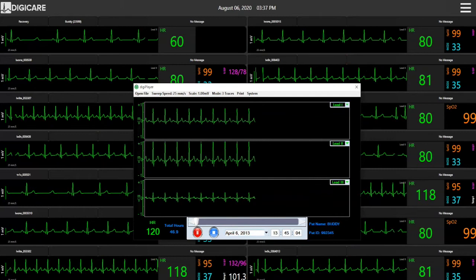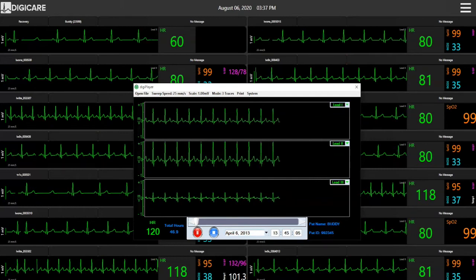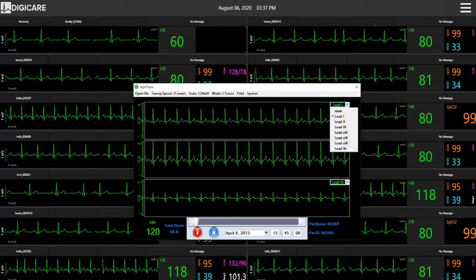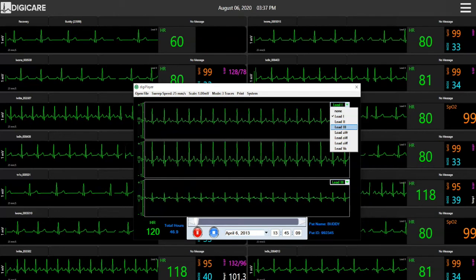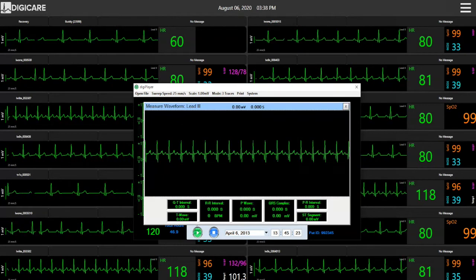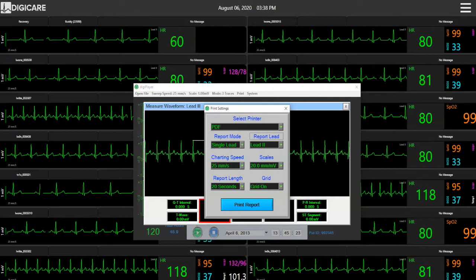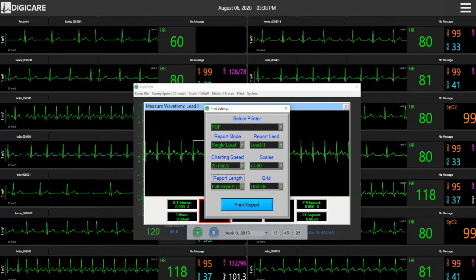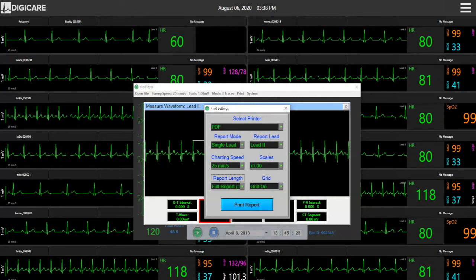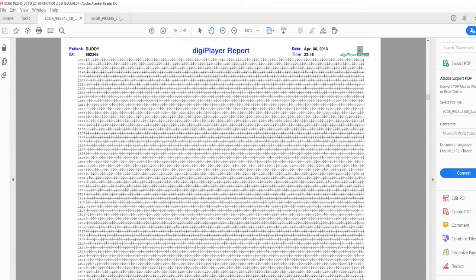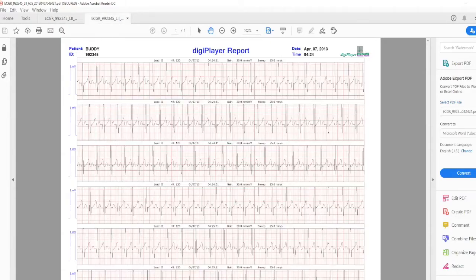The ECG recorder can save up to 48 hours of ECG waveform data. You can select which lead you would like to view and take measurements using the software tool. You can print a full disclosure ECG report of your patient to quickly scroll through the entire data, then print a detailed report of specific areas desired.